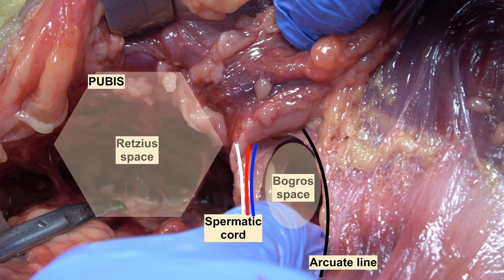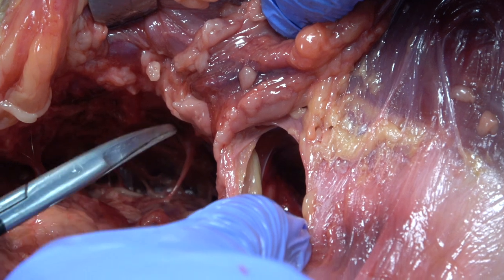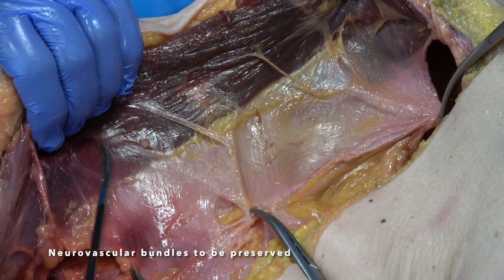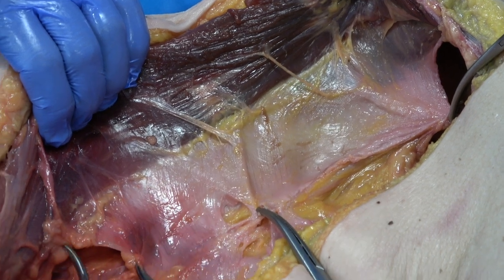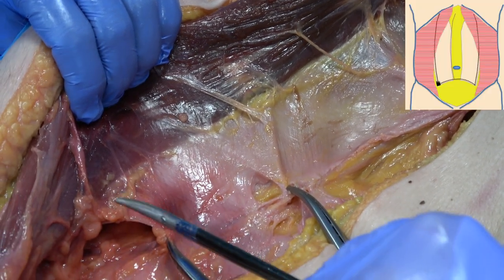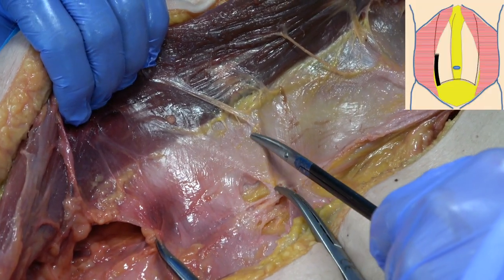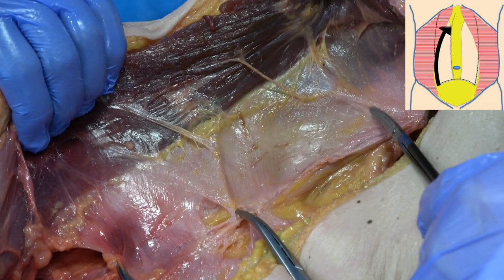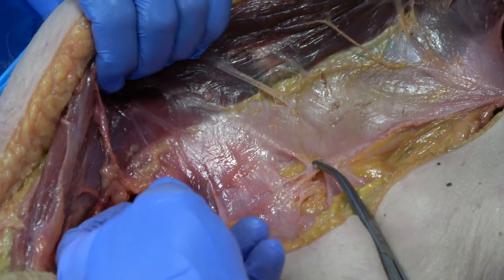Sometimes the peritoneum can be very attached to the lateral border of the arcuate line. Having performed the periperitoneal pre-transversalis dissection first — superiorly at the epigastric and sub-xiphoid areas, and inferiorly at the Bogros spaces — we are ready to start the posterior component separation.